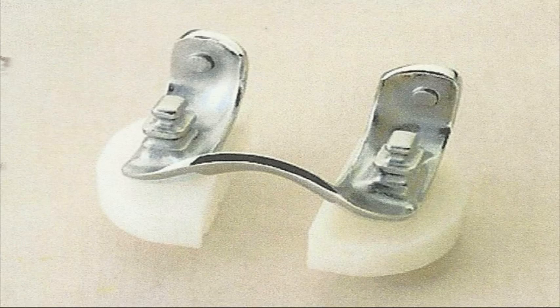The two halves of the femoral component became linked. The duocondylar knee, designed by Ranawat in 1973, linked the two femoral metal runners. This was size limited and without instrumentation. Anterior knee pain was a problem, as there was no patellofemoral joint. Patelectomy was often performed to overcome the anterior knee pain. A patellar flange was added in 1975 and became the duopatella.